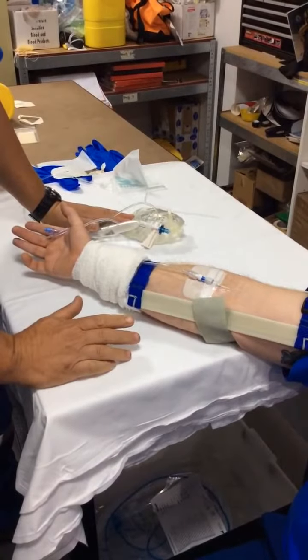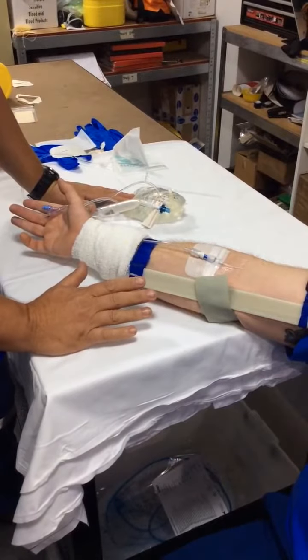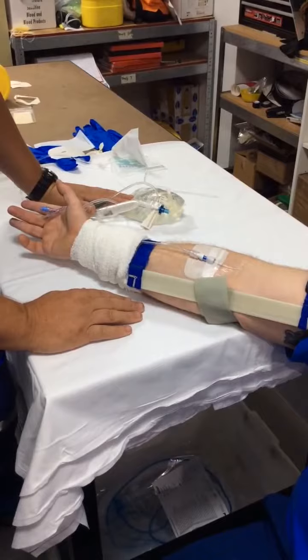So that's an overview of how we'd like, ideally, the fluid line and the arm lock to go in place. Thanks for your time.